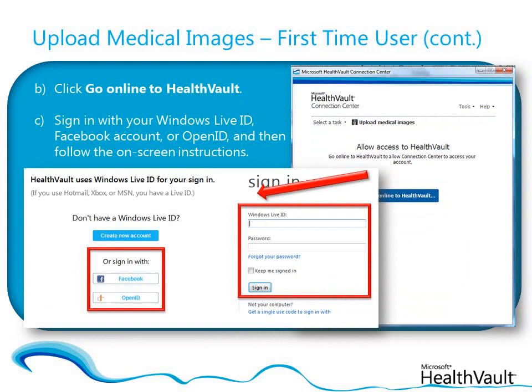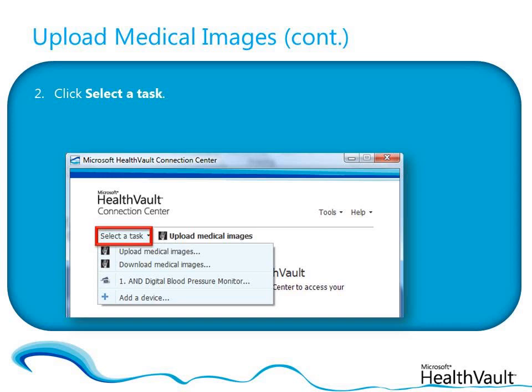Then follow the on-screen instructions to link Connection Center to your HealthVault account. When you've finished linking Connection Center to your HealthVault account, or if you've already done so, in the Connection Center window, click Select a task and then click Upload Medical Images.